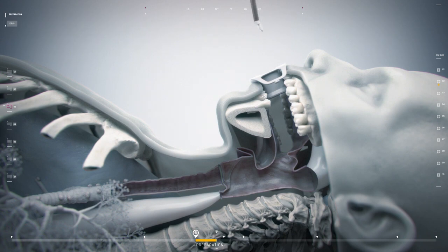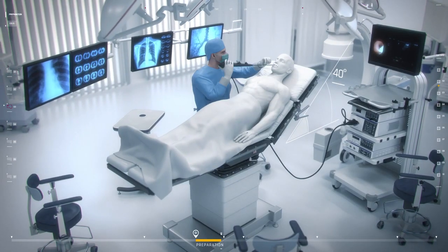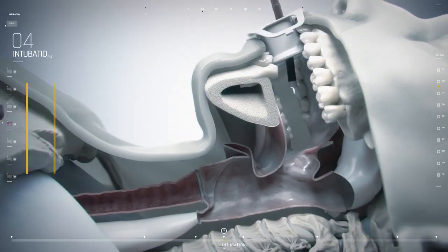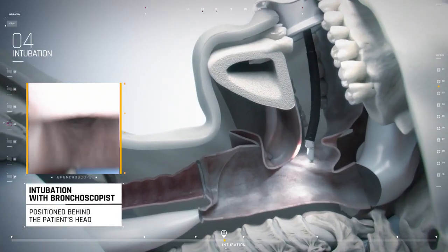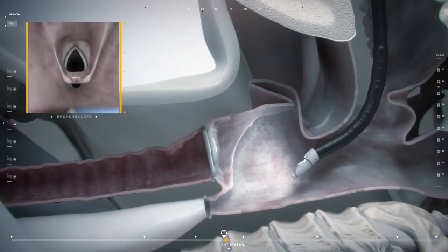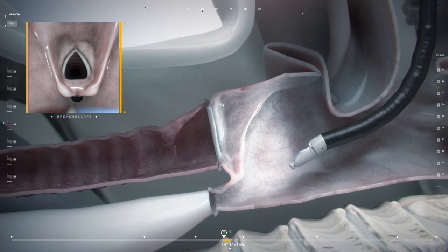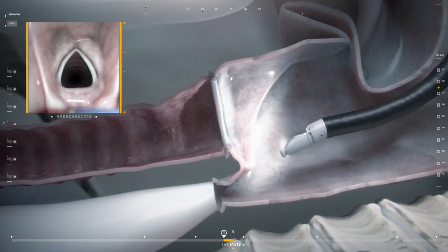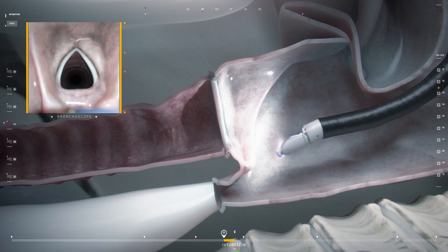Once the patient is comfortable, the bronchoscope is placed through the mouth and into the trachea. It can be performed facing the patient or standing behind the patient's head. Care is needed when intubating the trachea. Often, only the anterior apex of the vocal cords is visible as the scope enters the subglottic space. As the bronchoscope approaches the cords, remember that the tip of the EBUS scope lies below the forward view of the scope.